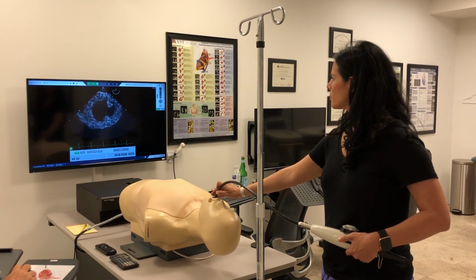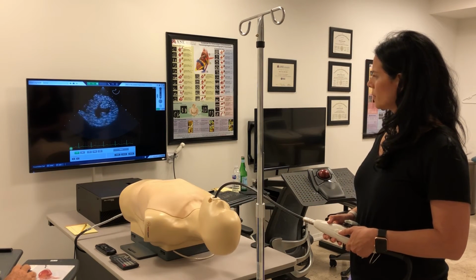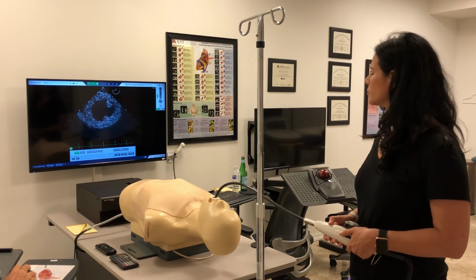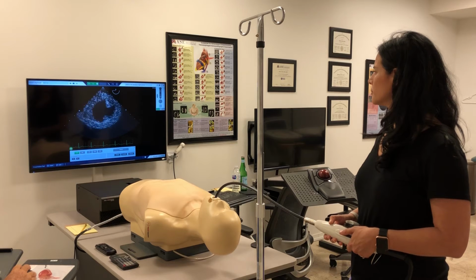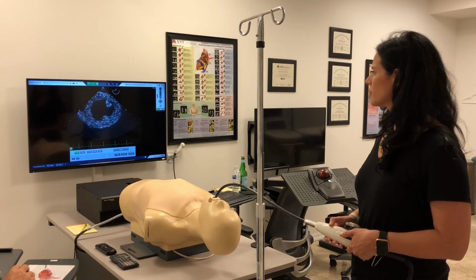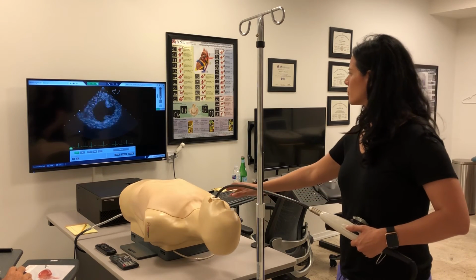Remember that this is the inferior wall next to the probe. The probe is sitting in the stomach looking back up through the diaphragm at the heart. The heart lays on its inferior wall. So that wall closest to the probe is the inferior wall. So once you know that that's the inferior wall, you know the wall across from it is anterior. This wall dividing the RV from the LV, well, that's got to be the septal wall. And opposite the septal wall is always the lateral wall. Good. Now let's develop the next view, which is an easy view to get from here.